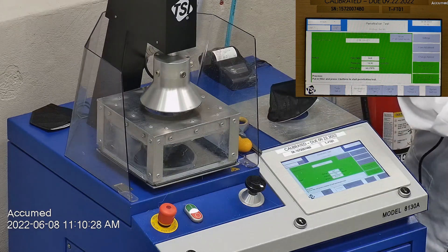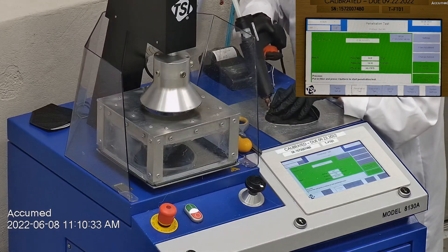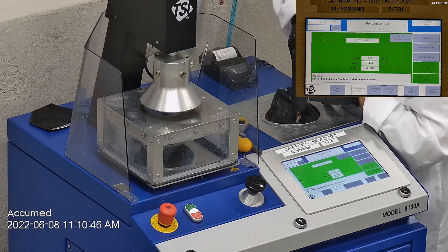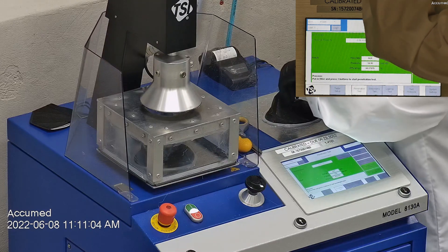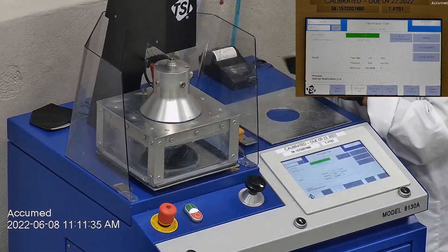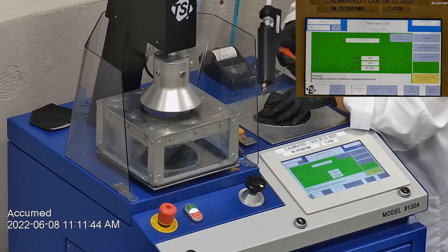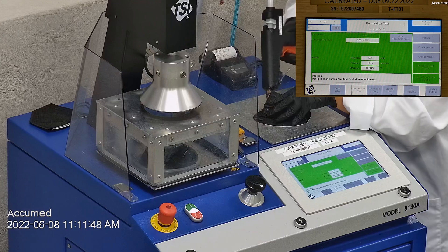The first sample tested at 99.27% filtration efficiency and had a pressure drop of 14.3 millimeters of water. The second sample had a filtration percentage of 99.21% and a pressure drop of 12.5 millimeters of water.